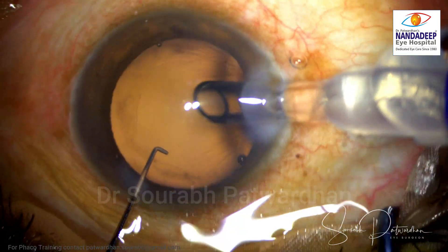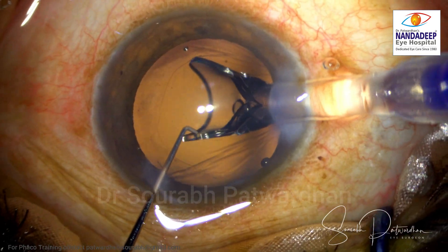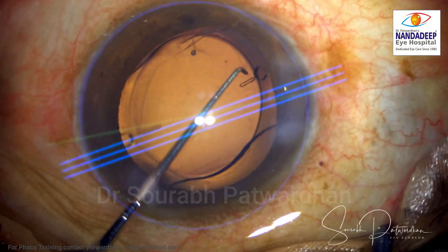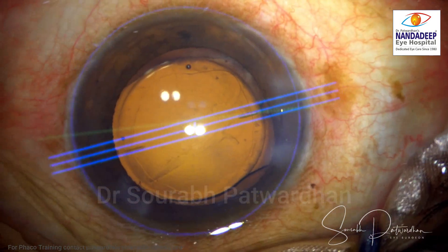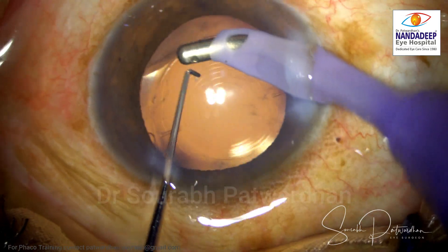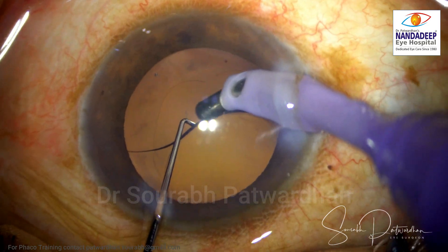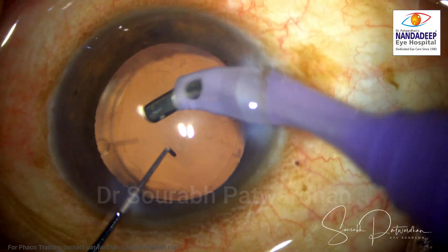So this is the end of the surgery. The anterior chamber is now filled with hyaluronate. I am going to put a plate haptic toric trifocal IOL. For these kinds of IOLs, I prefer to use hyaluronate in the bag because removing the OVD behind the IOL is tricky at times. For plate haptic, I rotate the IOL to the axis where I want to implant first, and then push it into the bag. This makes it easier because it's always difficult to rotate once the plate haptics are in the bag. This is how to remove the OVD from the bag under the IOL — we have to nudge the IOL to one side and then try to remove the OVD from the bag. This is important because otherwise we'll have capsular distension later.